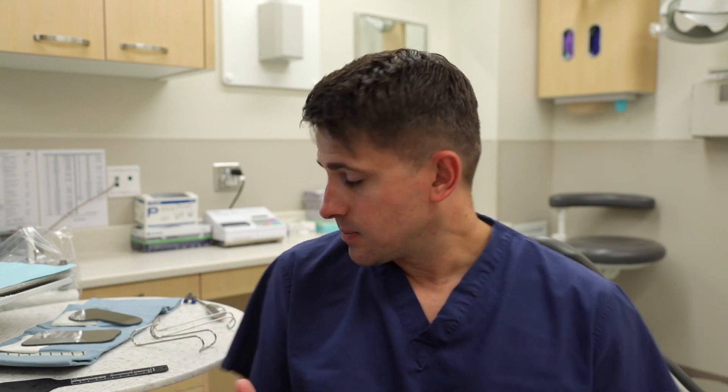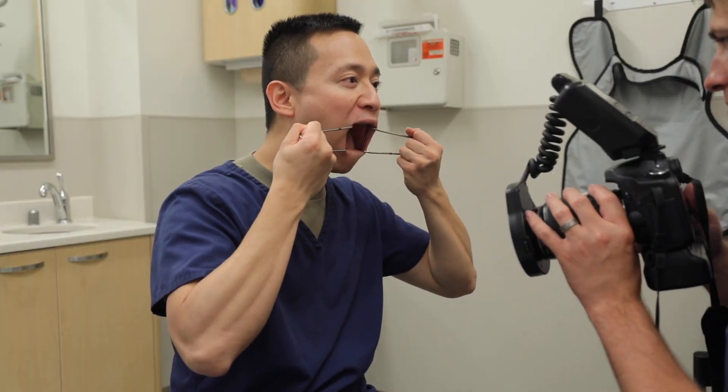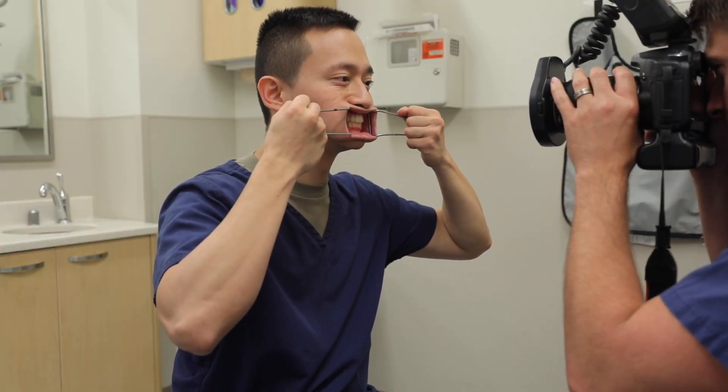In addition to your camera, you're probably going to want to get some other things as well that will give you different angles and allow you to see different views of the teeth. You'll sometimes need something like retractors — what I have here are an example of metal retractors. You can also get clear retractors. Either way, they're designed to retract the cheeks and lips off of the teeth so you can see the teeth more clearly.